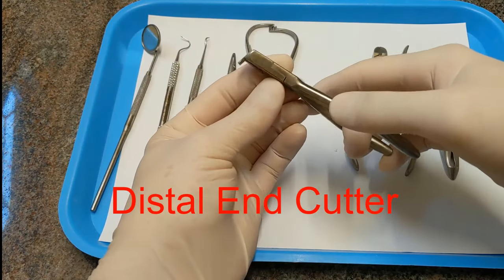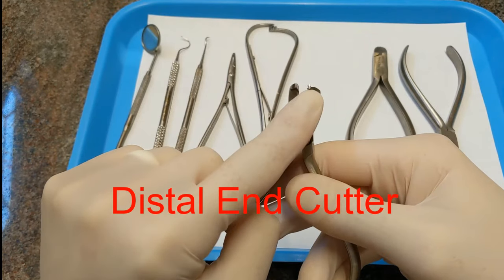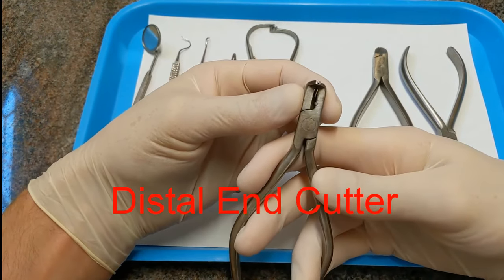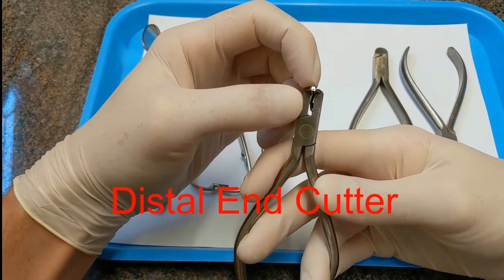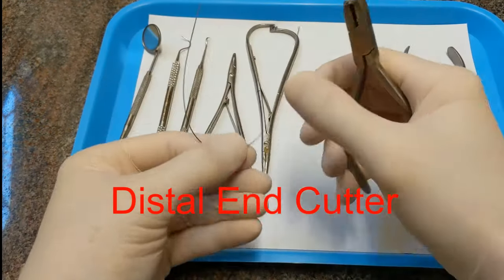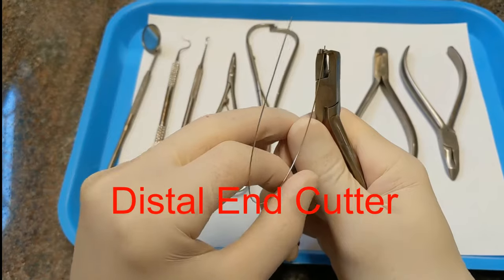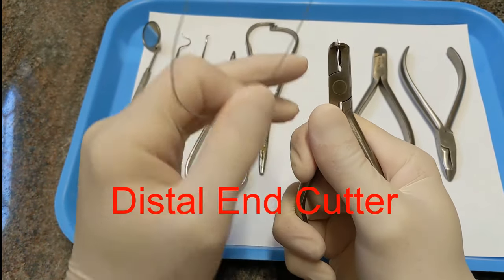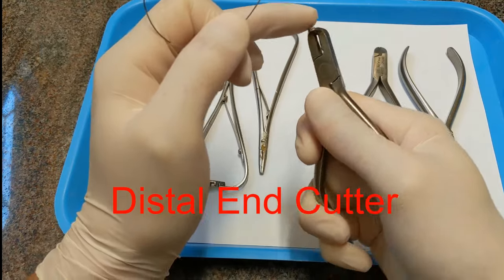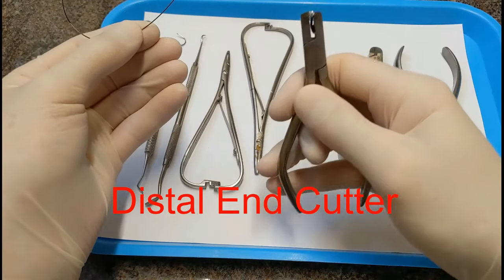This is called a distal end cutter. It has jaws with a flat side and a cutting side like a chisel that meet together and cut arch wire. This little round thing fits up against there and holds onto the cut end of the wire so it doesn't fly off when you cut it. When you cut the wire in the mouth, you keep a hold of it and that little bit of wire will fall off without shooting into the patient's mouth. It's called a distal end cutter — it's for cutting the distal end of the wire.